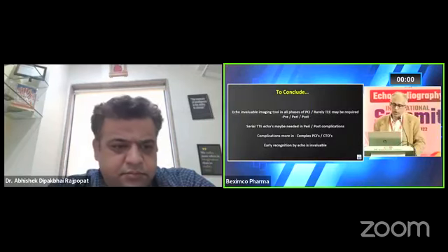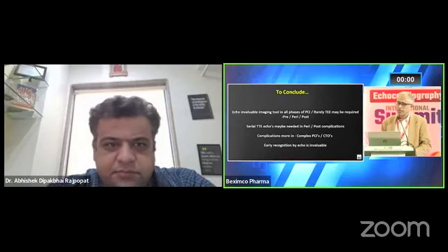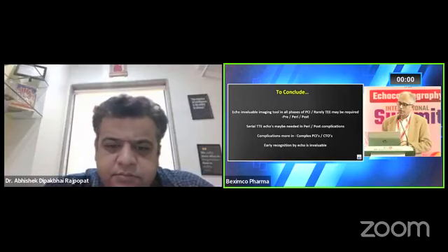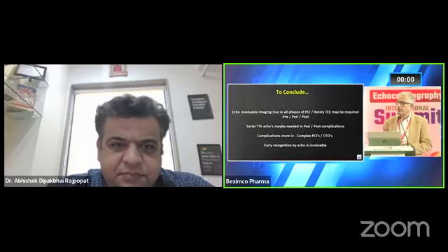So to conclude, echo is an invaluable tool in all phases of PCI. And once in a while, you might want to consider TE in some situations. So these are the various scenarios. And transthoracic echoes definitely can be helpful, and the complications are more in complex PCIs and CTOs. Early recognition is what echo can be really helpful for, and it's invaluable.